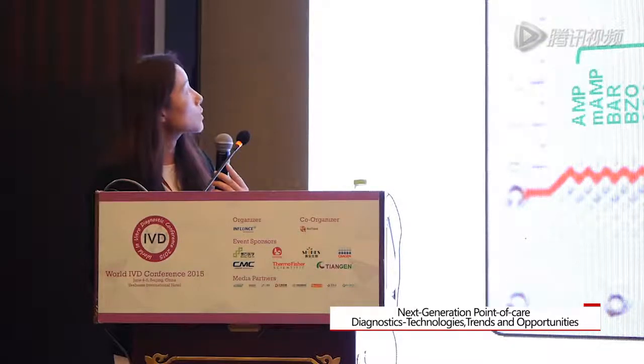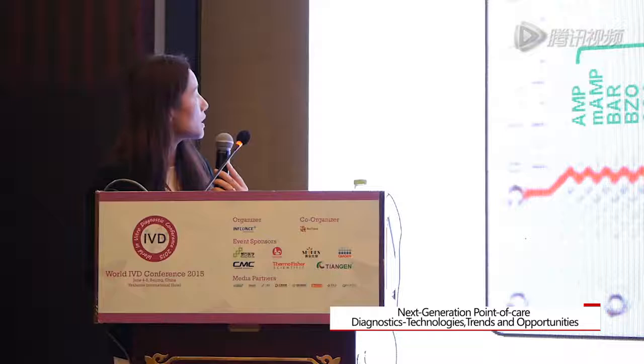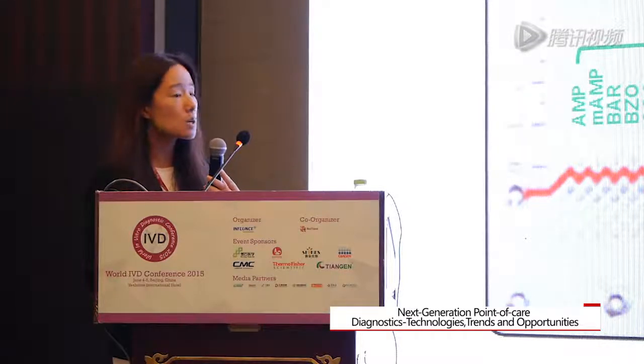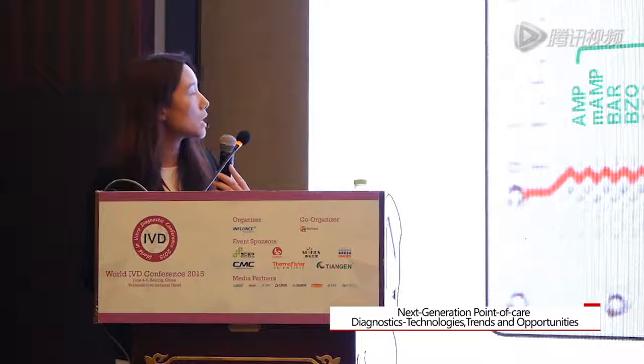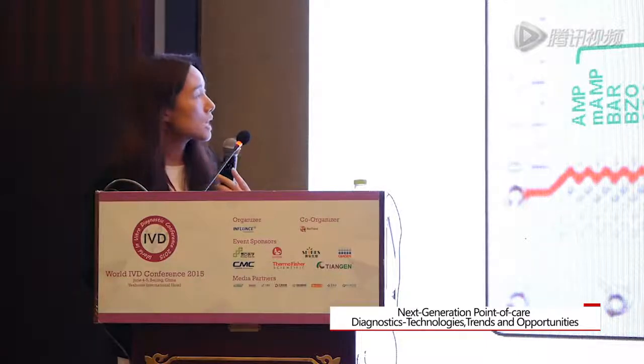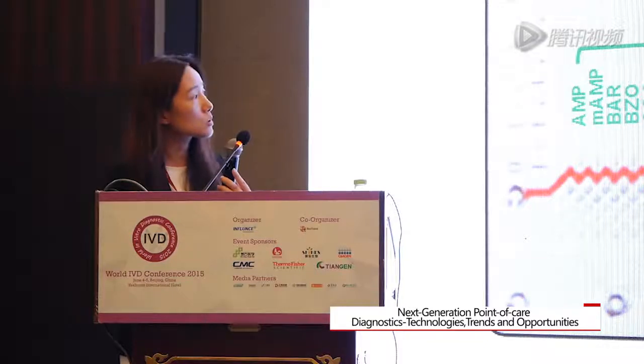So as we can see here, we can use either the patient's urine or blood, and we can detect many different drugs at the same time, for example, amphetamine, cocaine, benzodiazepine, and then methadone, PCP, etc. So the 7 to 9 different drugs we routinely detect in the clinical lab can be done at the same time on this piece of equipment. And then you can also build in quality controls at the same time to ensure the quality of the results.